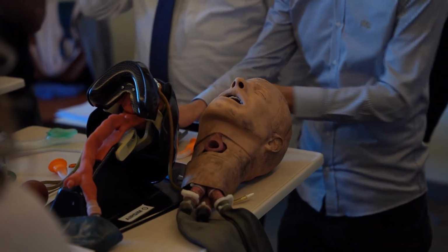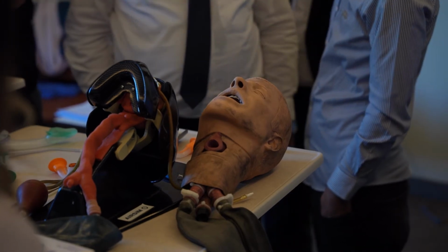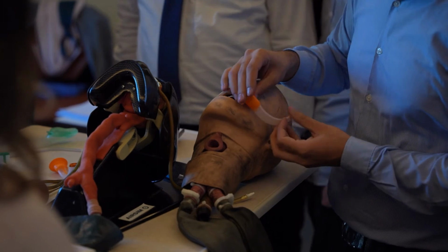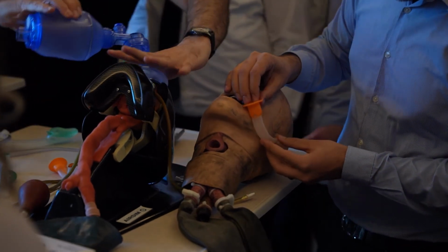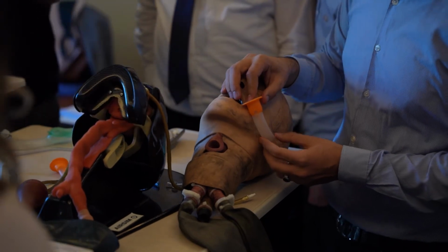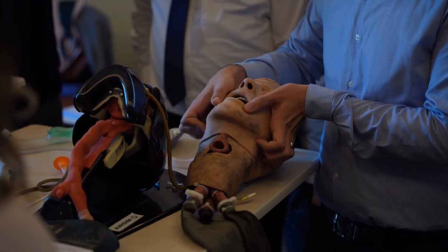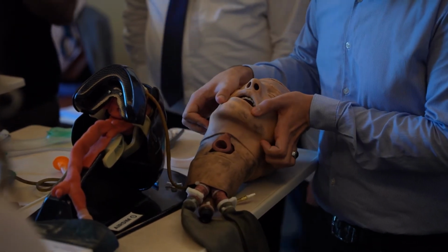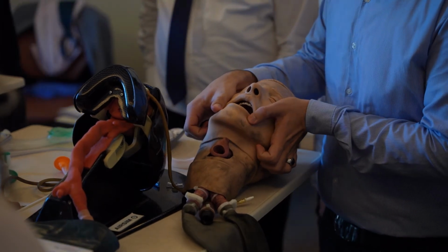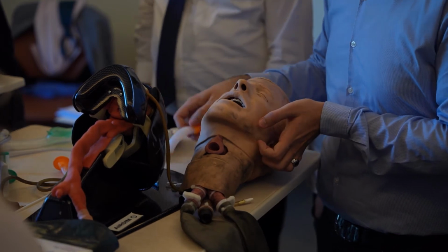Okay, this is called a bag valve. There is a valve here, and this is a mask. The holding of the mask will be like that, C and E. Either you are alone, you are going to hold it like that. The apex of the triangle on the bridge of the nose, the base just encroaching the angle of the mouth, and it should not be on the eye. C on the mask, and E you are holding the mandible.